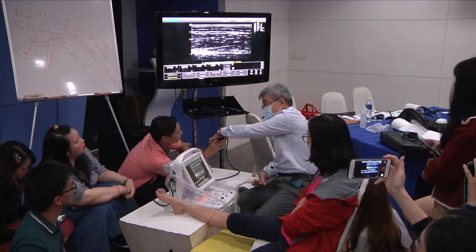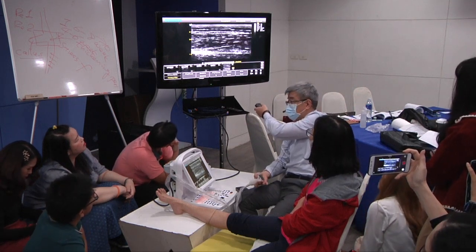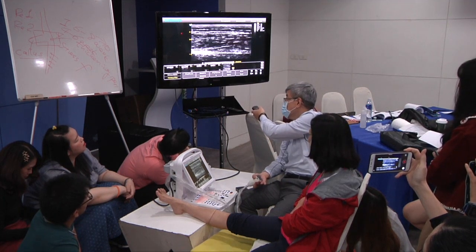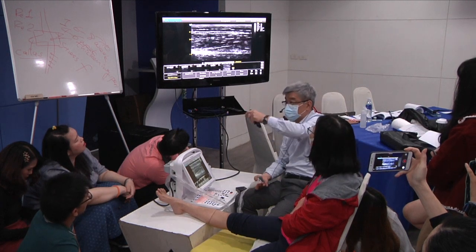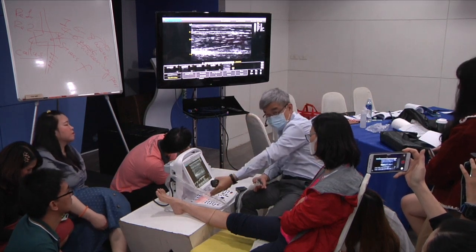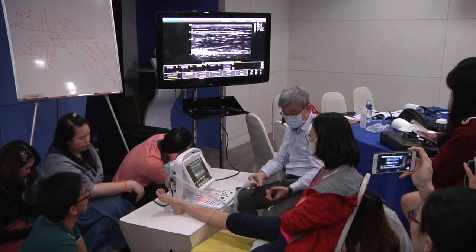Thank you. If you are looking at the tendon of tibialis anterior, tendon, bone. Look at the extensor hallucis longus, tendons, muscle fibers. Because, as I said, the extensor hallucis longus muscle belly is lower. So, in the lower leg area, you can still see the muscle fibers.